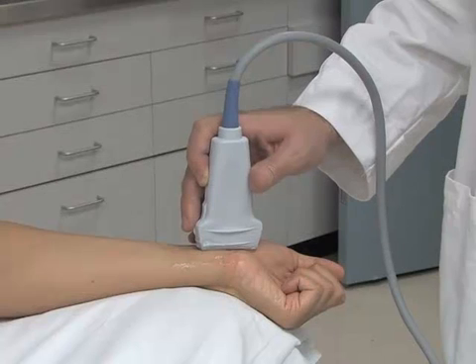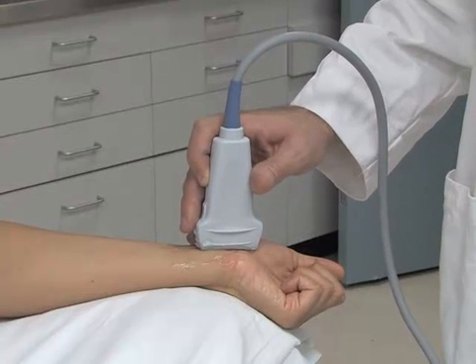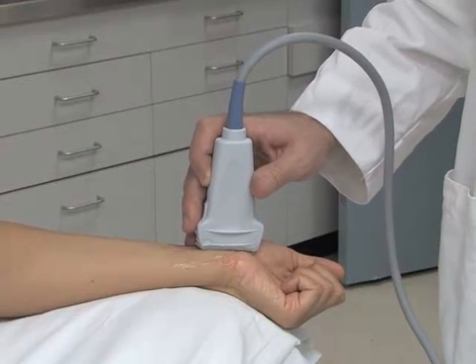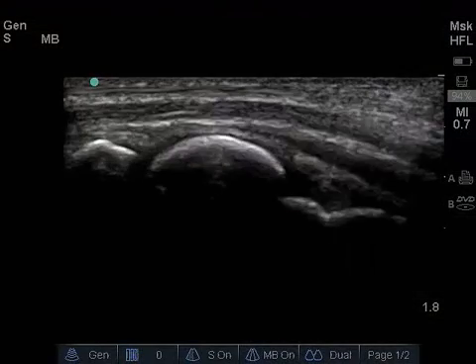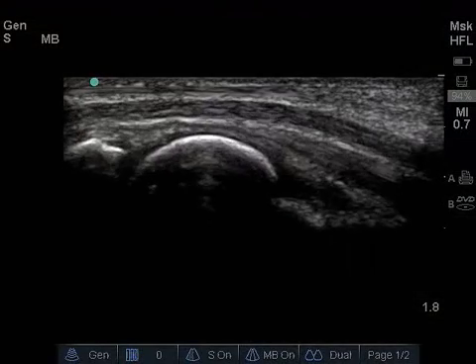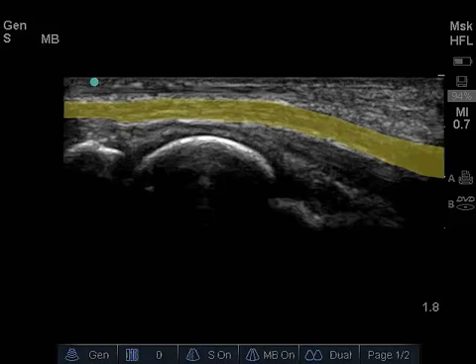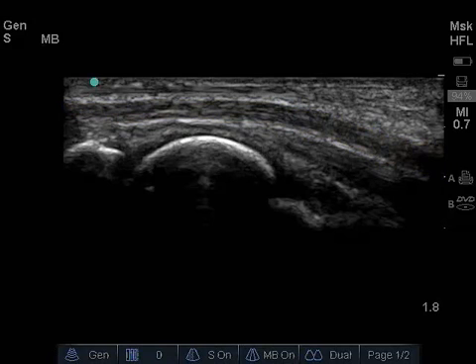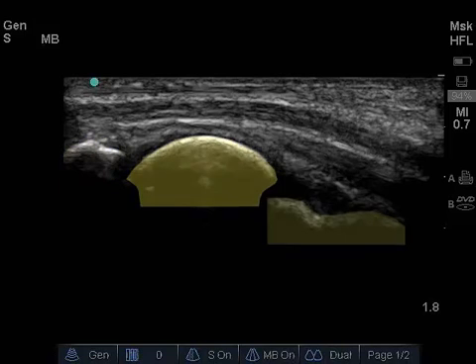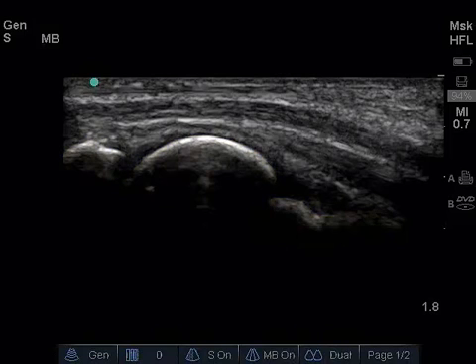Turn the transducer 90 degrees to obtain a longitudinal image of the median nerve. The median nerve is differentiated from the deeper flexor tendons by visualizing the hypoechoic fascicles characteristic of a peripheral nerve. Note the bone contours of the radius, lunate, and capitate for orientation. The normal median nerve has a uniform caliber as it courses through the carpal tunnel.